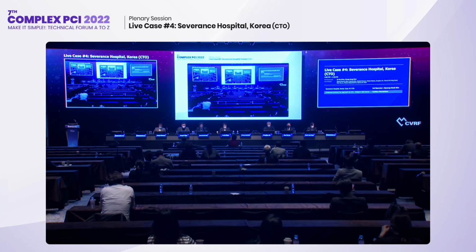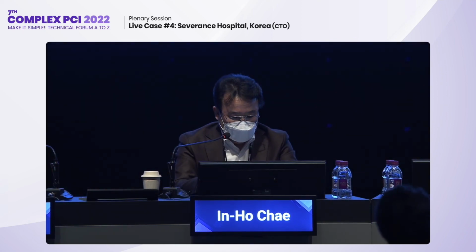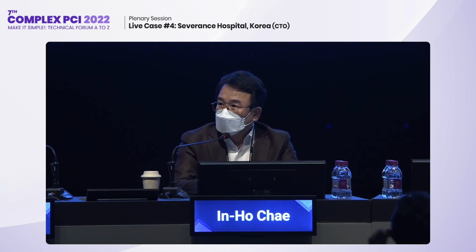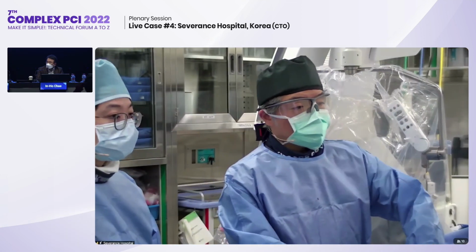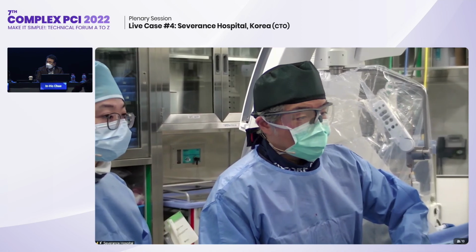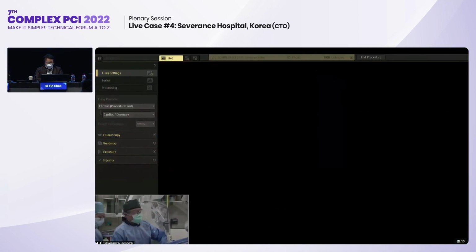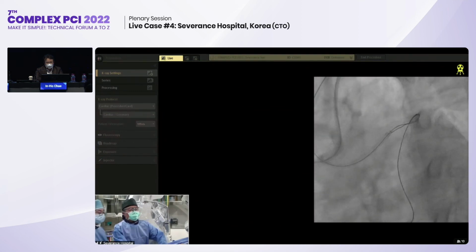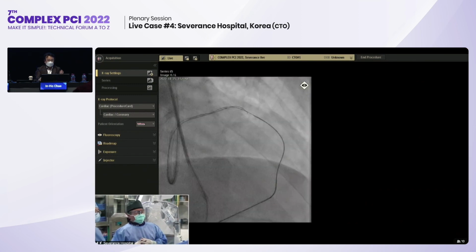Lecture about the guidewire selection during the PCI intervention. Because we are far behind the schedule, can I close this session? Yes. Okay. So, Dr. Kim, we are back. Please explain what you did. Okay. Could you show me the slide?